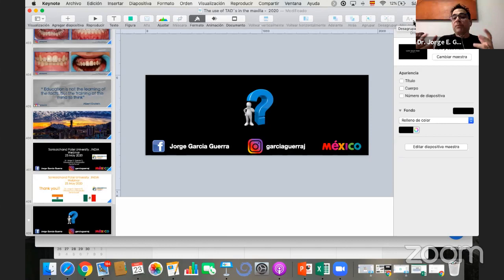That's why I use the mini implant. But I agree with you, only about 3 mm. I don't try to do a lot of it because it's not stable. It's not going to work. And on the other cases that were four bicuspid extraction that had previous treatment, I tried to do en masse retraction. Okay. What I used the mini implants for was the intrusion.